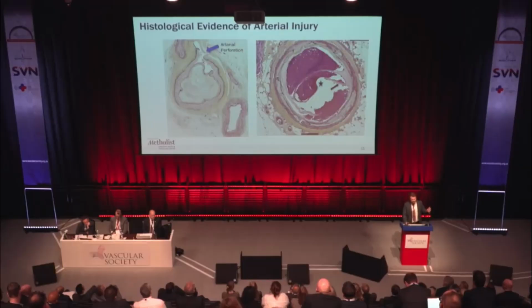We compare this to a soft lesion. We can see that the star is showing you the catheter imprint. So we've gone straight down the lumen. But the arrow is pointing to intimal injury. So even just with wire crossing in soft lesions, we were seeing some form of vessel wall injury in 50% of cases. It was higher in hard lesions, over 80%.